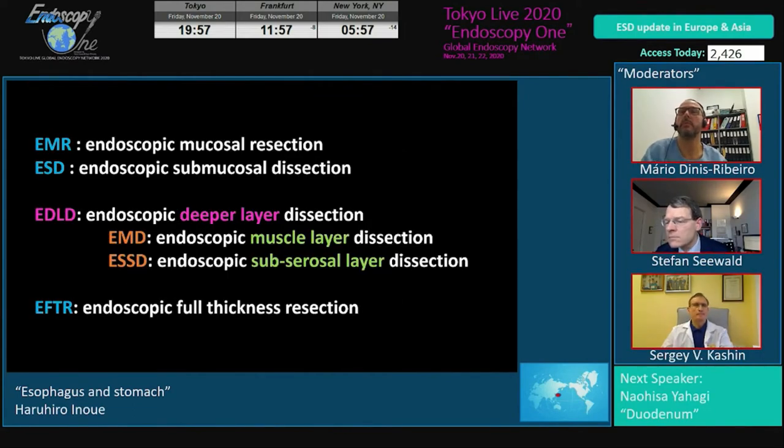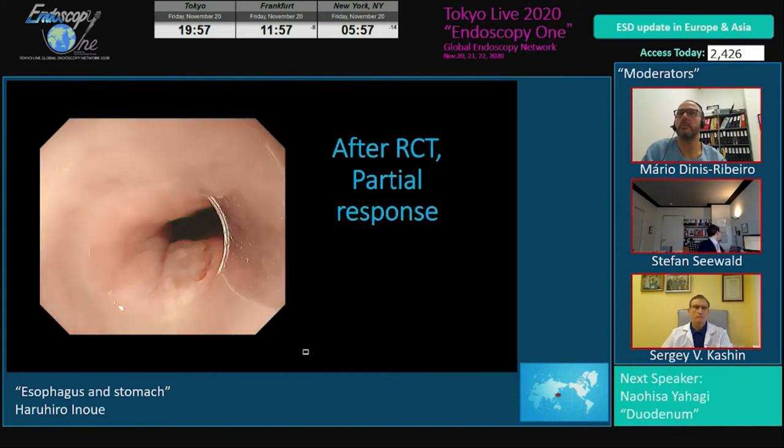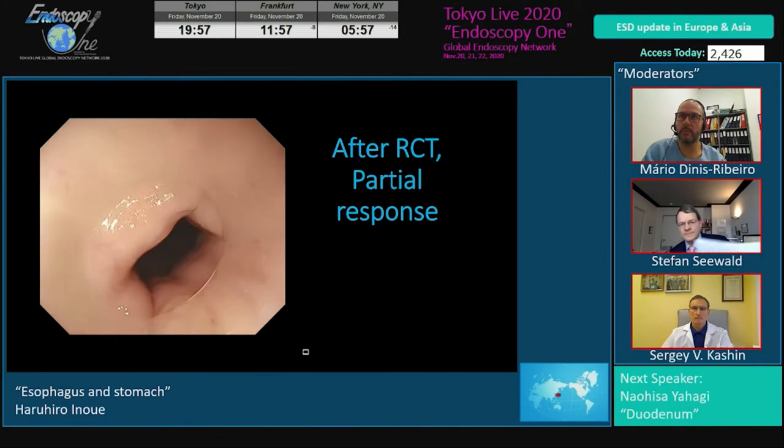So next, I would like to talk about endoscopic muscle layer dissection. It's a deeper layer dissection than regular ESD. This is a case of squamous cell carcinoma after RCT. Still the tumor remains.